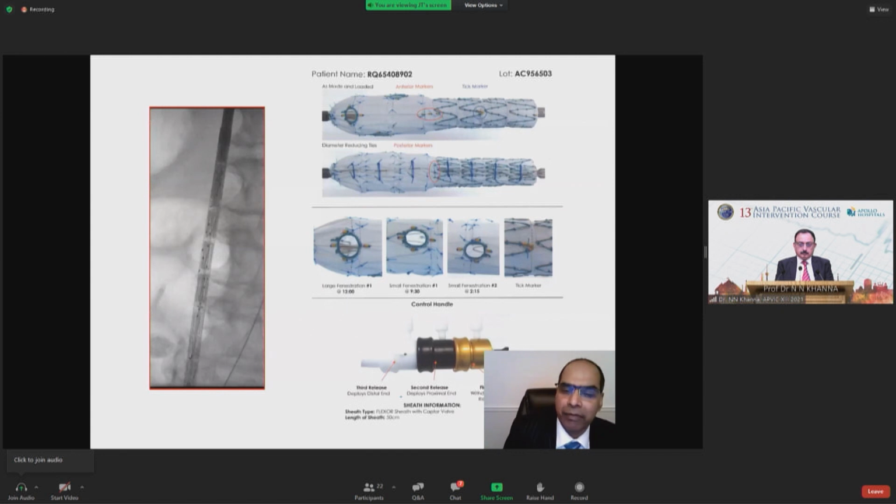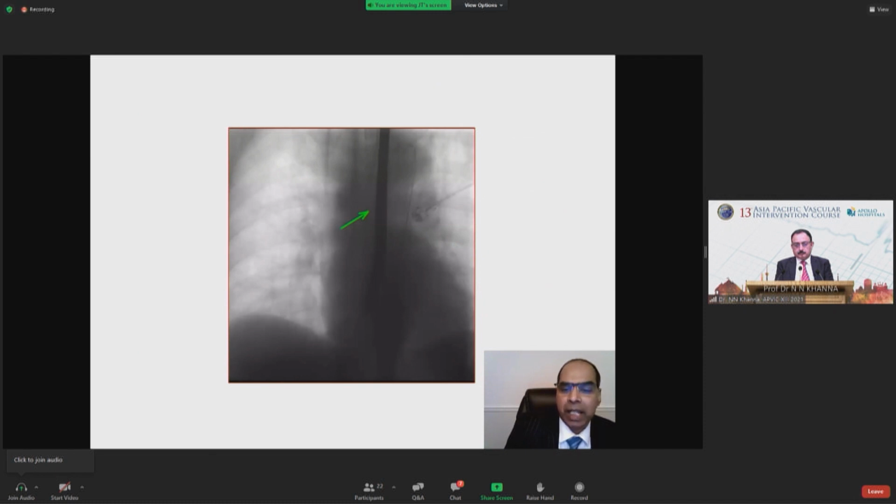This is more information about the device you're implanting at this stage, and how each of the fenestrations look, and how the unconstrained device looks before it is packed away. These photographs actually belong to the device that we have implanted in the patient, taken before the manufacturers loaded them into the stent graft system.